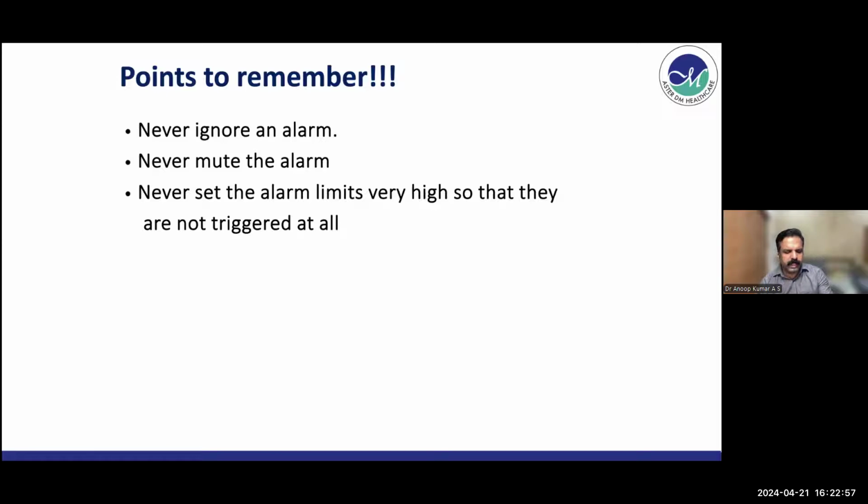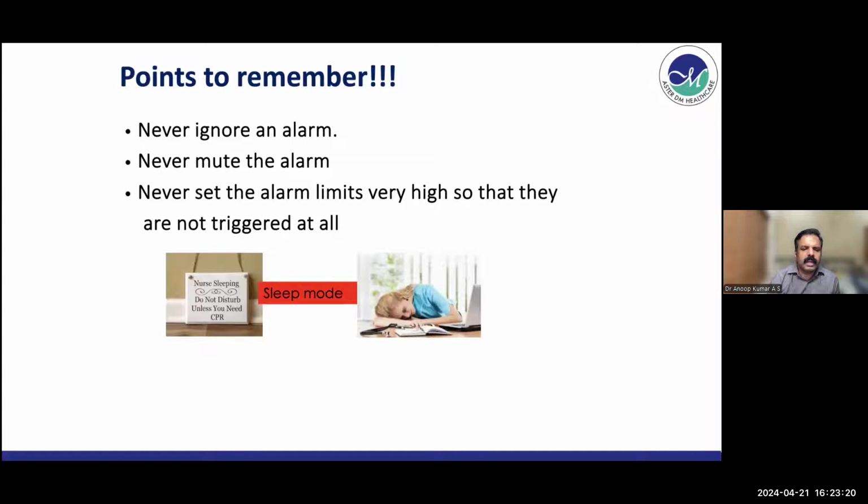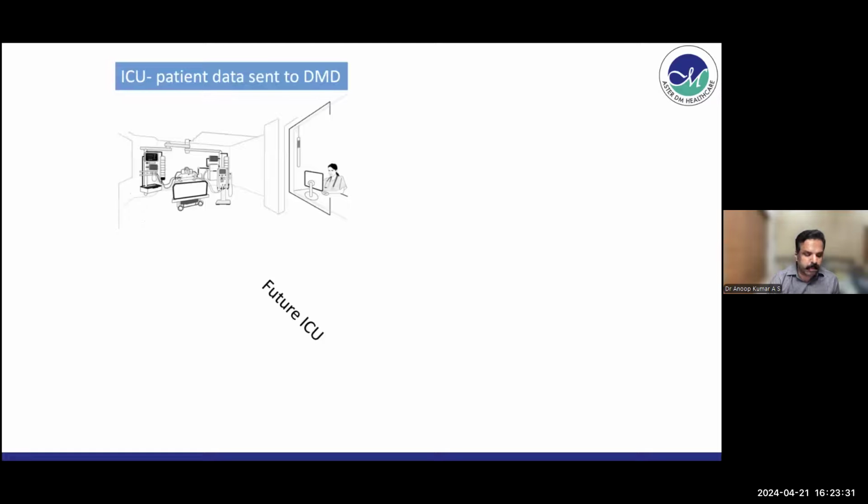Someone will do this as well. Sometimes you can have these same issues with peak pressures, respiratory rate, or apnea time. Everything you keep very high so that there won't be any alarm. Don't do that either. And whenever your bedside staff are sleeping or feeling sleepy, if you do that, you will miss all those important events which should have been picked up.